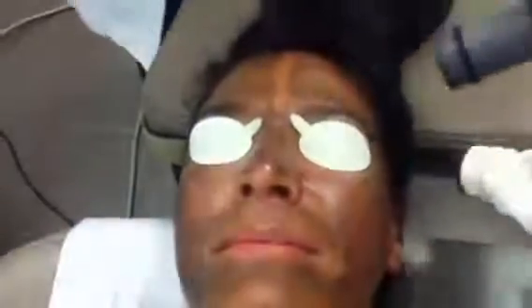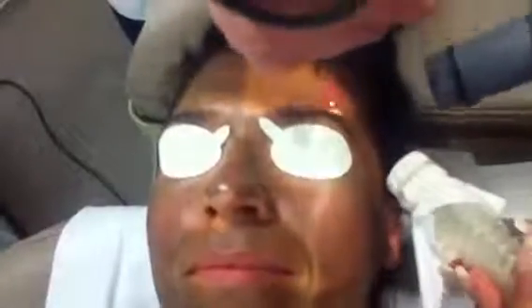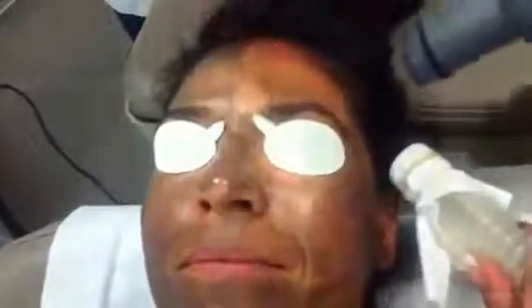In between the eyebrows — I'm going to adjust this just to make it a little bit bigger spot size wise. So this first pass takes off the carbon lotion. This laser is attracted to brown and black pigment, so it sort of blasts off that layer. Again, this just helps with the skin texture — makes things pretty and smooth. Patients have also commented that their skin after a series of treatments is so much more airbrushed and they wear less foundation.